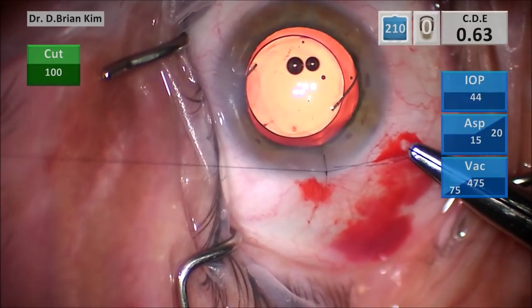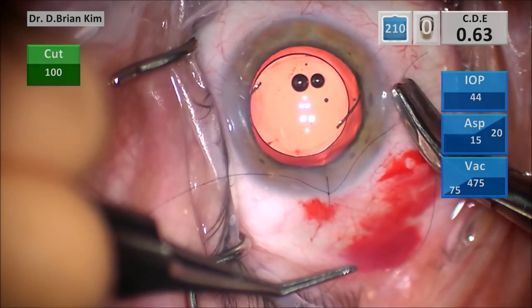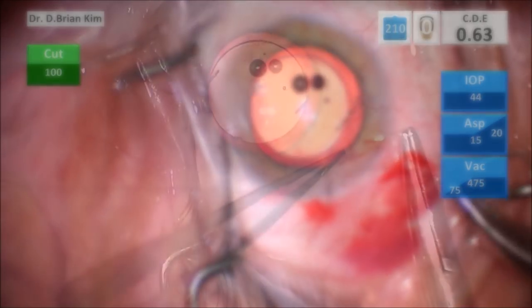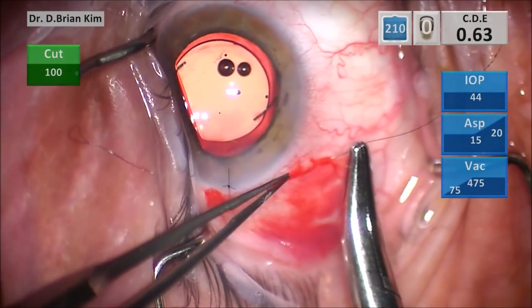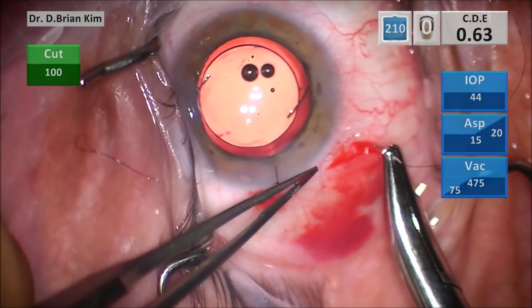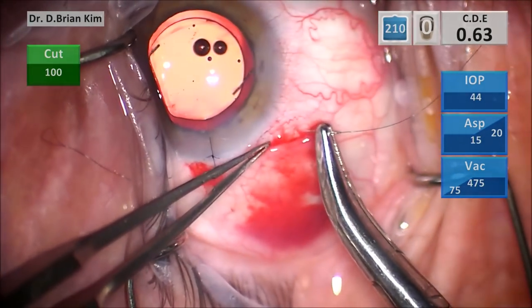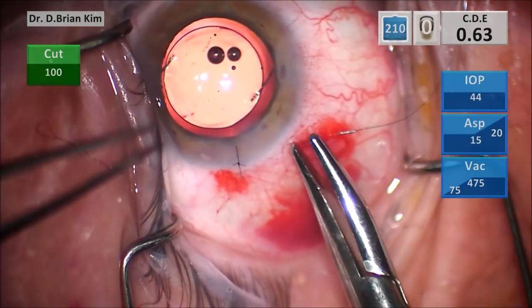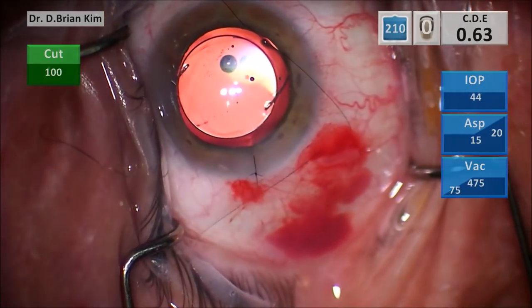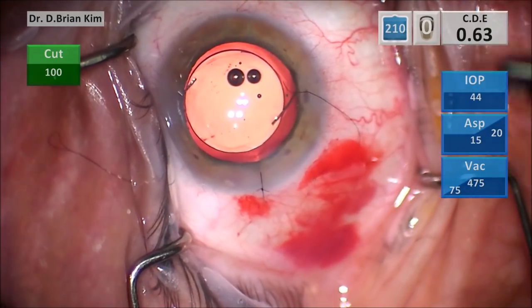Whenever I have a vitreous loss case, I like to put in a suture, just as the belt and suspenders method of keeping things under control. Patients can rub their eyes, and I have seen situations where patients rub their eyes and then the next day there might be vitreous to the main incision. And so this gives me some added security. And I'm closing the sclerostomy site. I checked before with a Weck-Cel sponge and there was no vitreous at the sclerotomy site either.